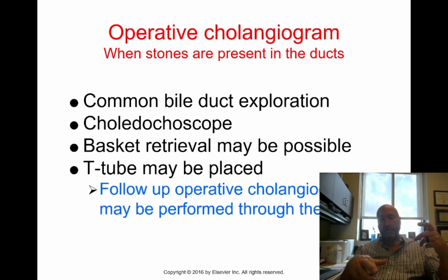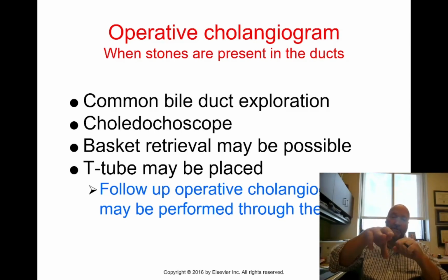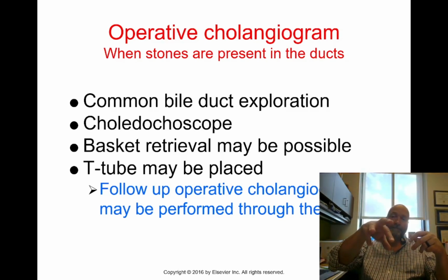It's got a plunger on the end of it, kind of like a needle. They put this thing inside of the duct and push it past the stone. And when they push that plunger, you find out that's not a solid wire, but a portion of it is three wires, and when they depress that plunger, they separate like that.